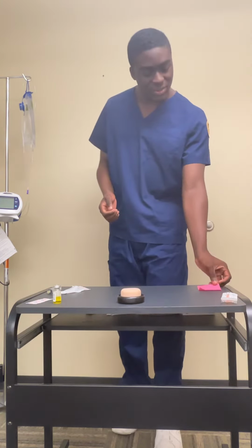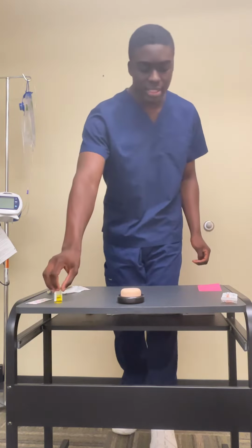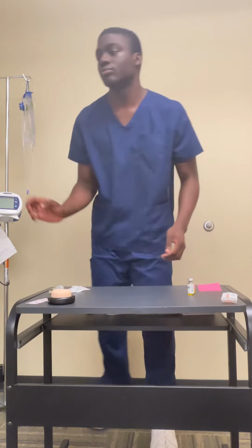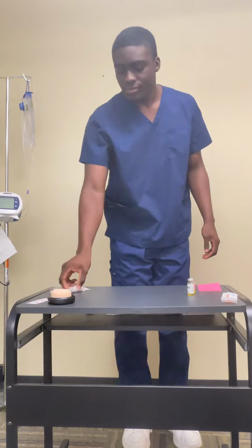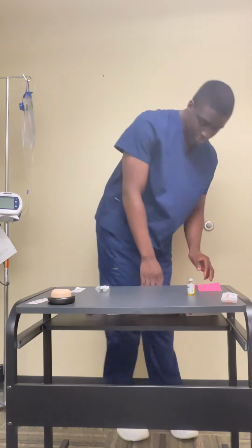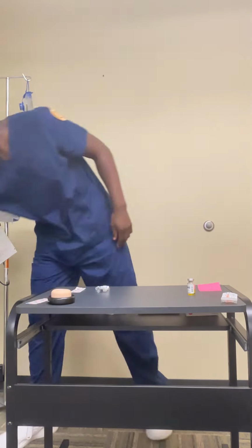And then I will go into the MAR and check to see if the order is in there as well. And then I will go into the medications room and I will obtain my 1 milligram of vitamin K. I will also get a 3 milliliter syringe and a 1-inch 23 gauge needle, which is appropriate for the administration, a Band-Aid, and some alcohol wipes.